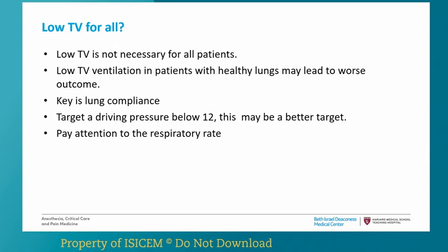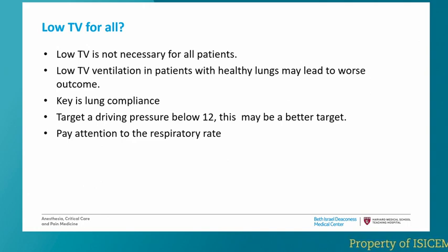And finally, a word of caution, pay attention to the respiratory rate. Often tidal volume is dropped and respiratory rate is increased. And if we go to the new target for mechanical ventilation, which is mechanical power, by doing that, you'll actually increase the mechanical power by delivering that harmful breath more frequently. So to sum up, low tidal volume for all, a resounding no.